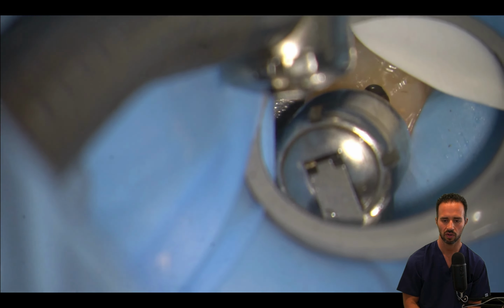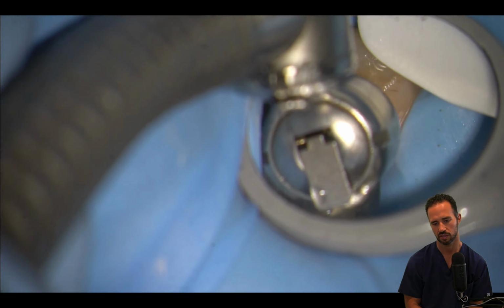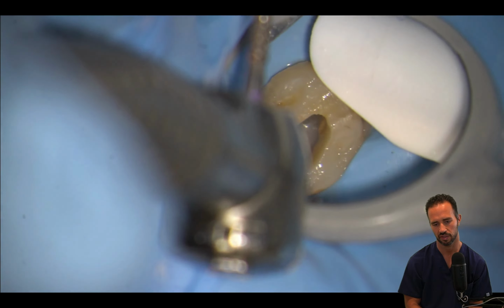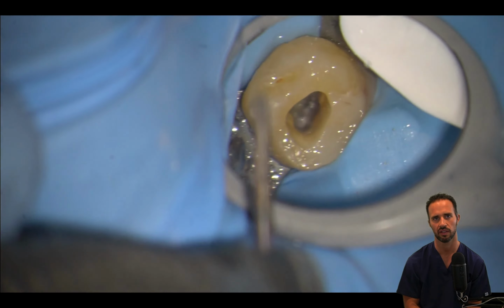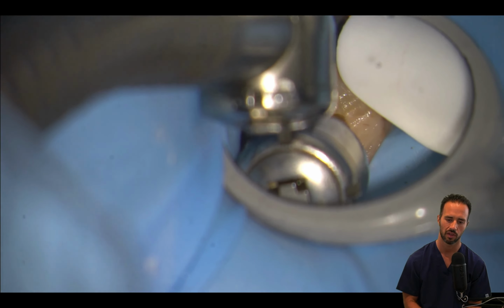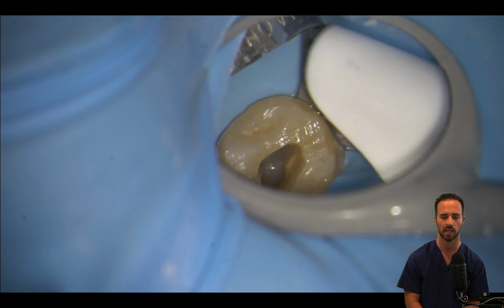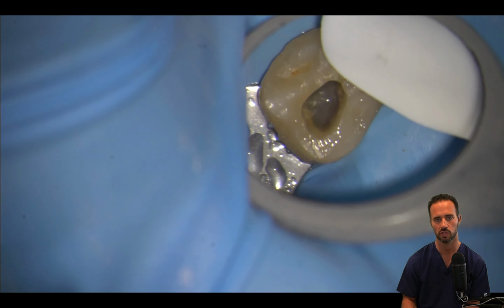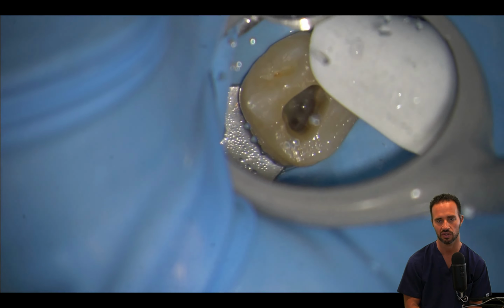So a little more unroofing of that dentinal bridge, just to be sure. You don't want to do this forever because you won't have anything left if you keep looking and looking and looking. And that's why this is really more of a lateral preparation when you're searching for the MB2 as opposed to an apical preparation. Because if you were just preparing apically at this point, you would have been deep into the furcation at this point, right?